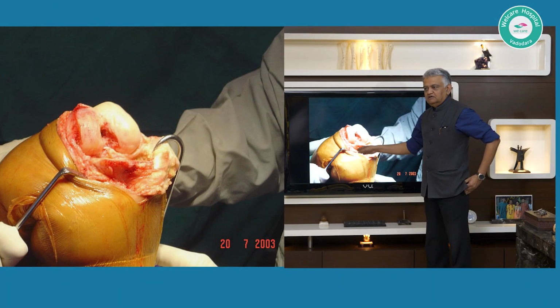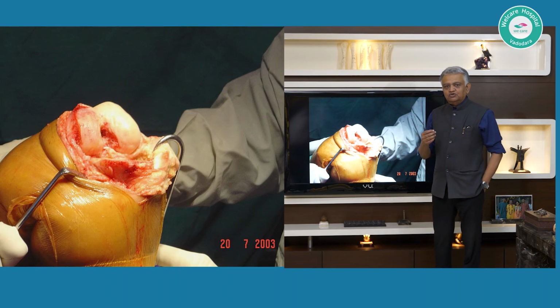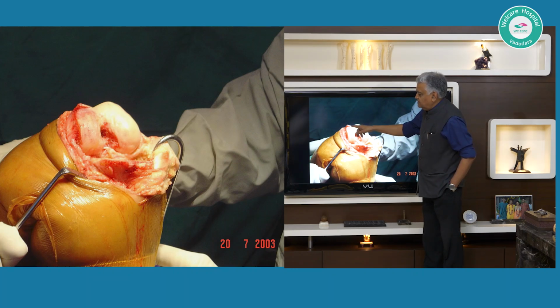So first of all, the most common question I am asked is, how do we decide whether you take the intramedullary entry point here or here or here? It's not actually... you don't have to be as finicky as 2 millimeter here or 1.5 millimeter there.